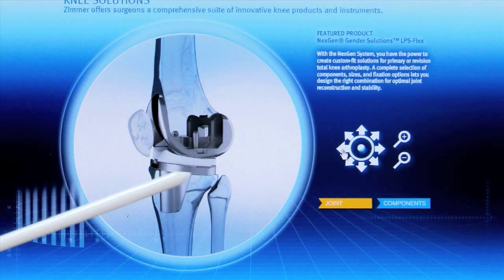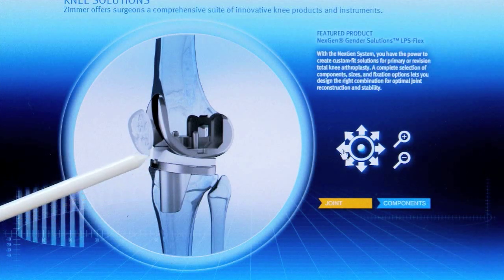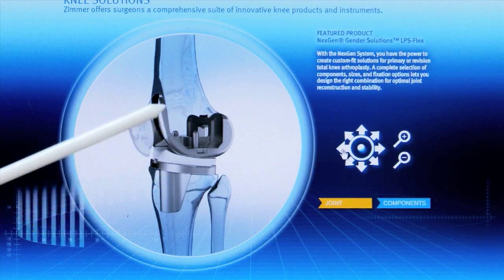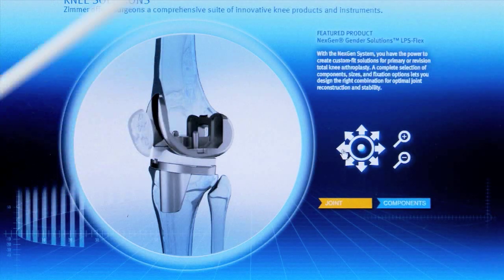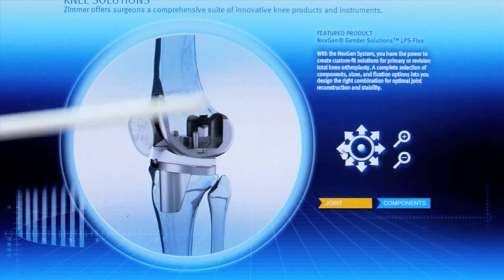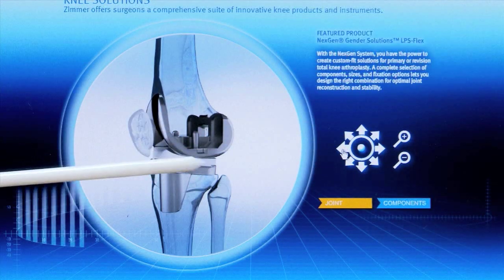On the tibia, we've got the tibial replacement — that's titanium — and the white there is plastic, that's a special form of polyethylene that clips into the tray. So this moves; that's it with the leg straight. And as you bend the knee, the thigh bone will go backwards and contact and move across the plastic.